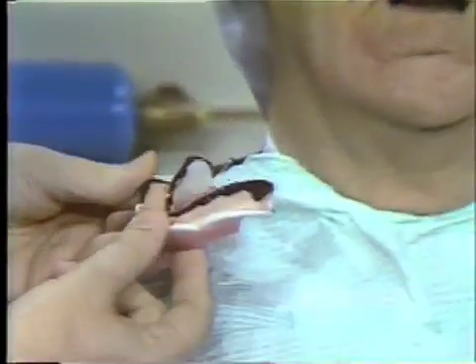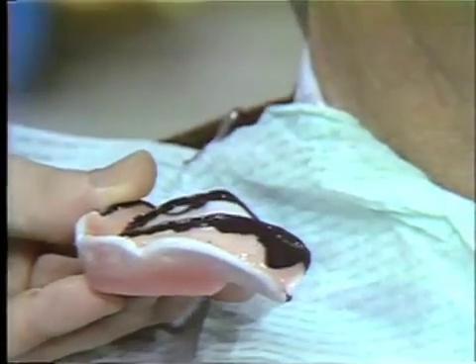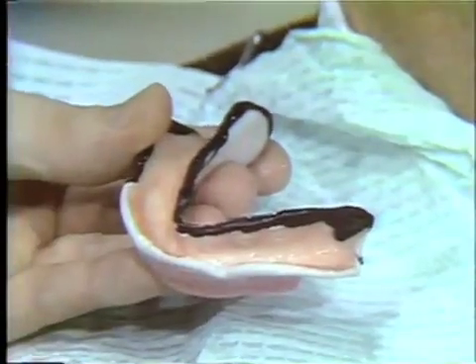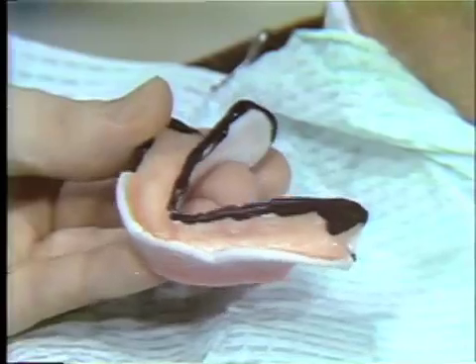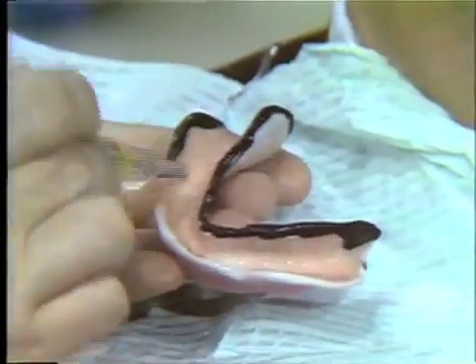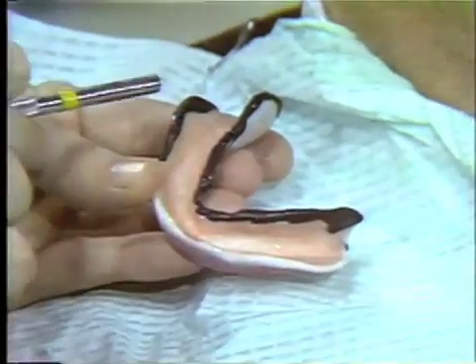Open please. Raise your tongue up, let your tongue back down, and seat this tray properly. Open — and you see we have a very nice rounded flange. The compound has come into the border of the tray; we will remove that with the sharp blade of the red handle knife, as well as remove the relief wax in preparation for the final impression using a wash material. For this particular impression we are going to use the light-bodied rubber base. In summary, the important point is that we did not completely border mold every aspect of the tray — we only border molded those segments that required it: the lingual flanges bilaterally and the left buccal flange. The two labial flanges and the opposing buccal flange were of adequate length.